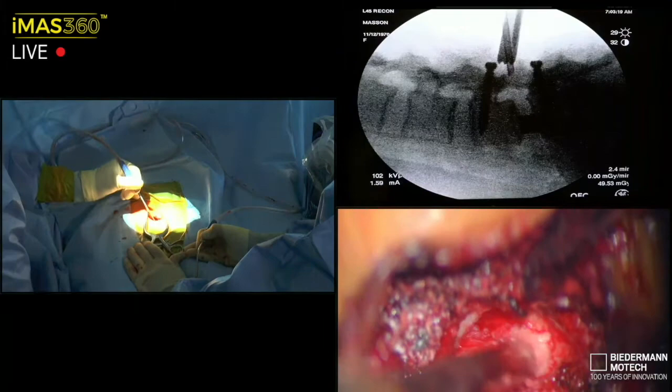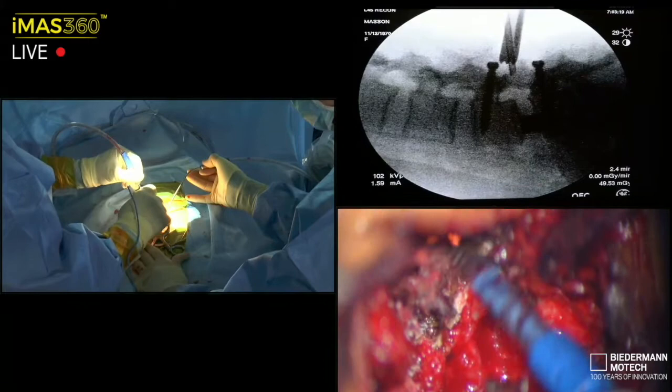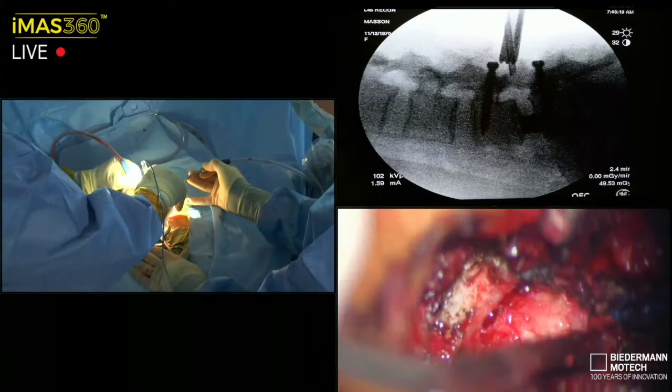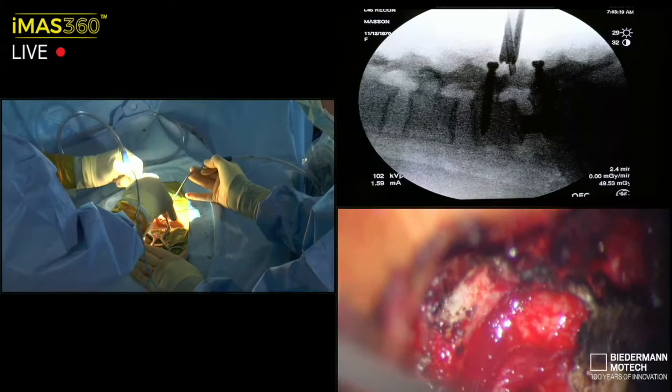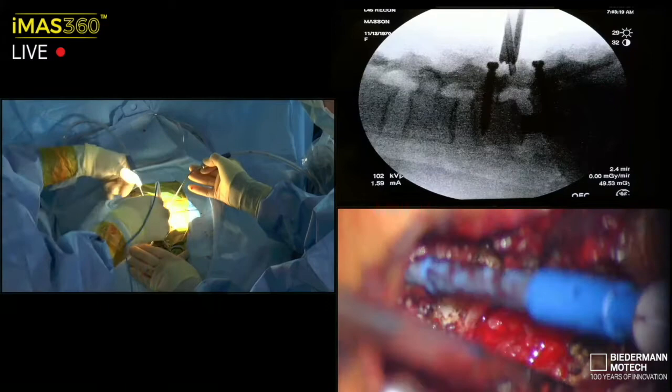All right, so now that I know where the dorsal thecal sac is, I'm going to do a more deliberate soft tissue dissection and get the entire base of the dorsal spinous process. I know I'm not going to hit the dorsal thecal sac here. Follow that bone here, follow it up here. Again, here's the thecal sac down there. So let's create that plane and develop it at an altitude that won't get you into that sac. But that's dorsal midline right there. Still got some soft tissue in the way.